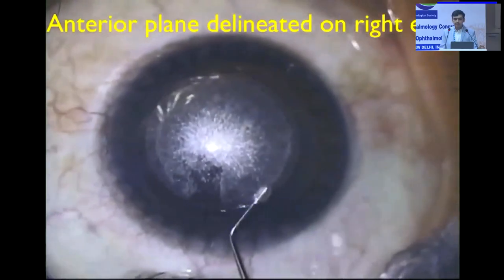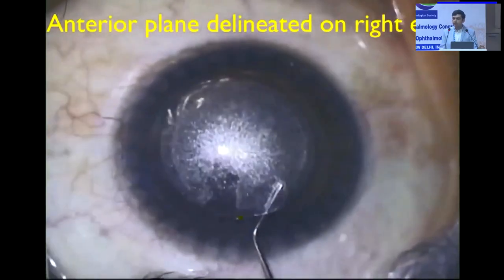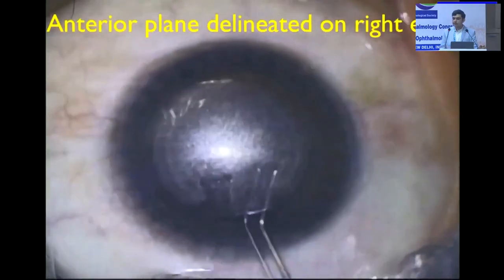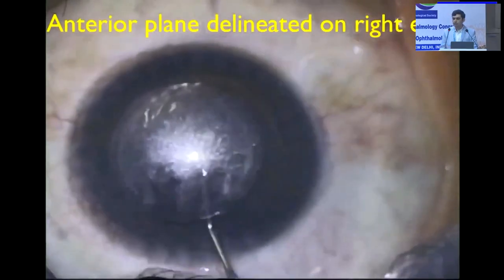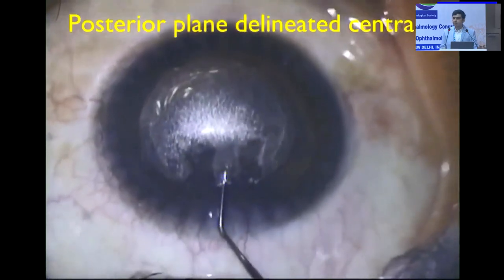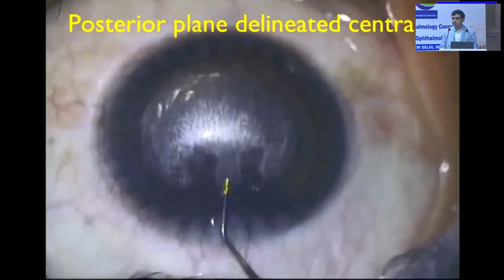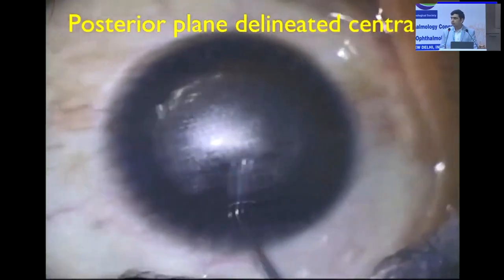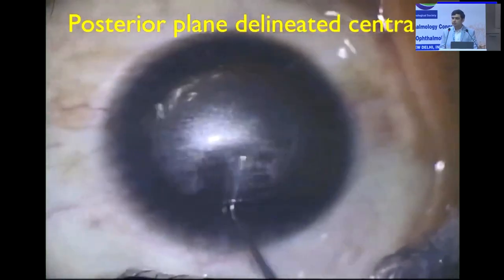Since the undersurface of the cap and the anterior lenticule surface are in line with each other, this maneuver ensures that you are doing anterior plane delineation only. When we do the posterior plane delineation, this is done in the central part, the central 1 mm area, and the dissector is entered straight in with slight posterior pressure on the cornea to reach the posterior plane.